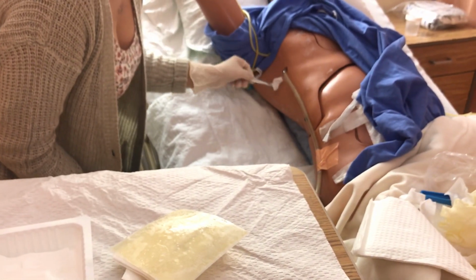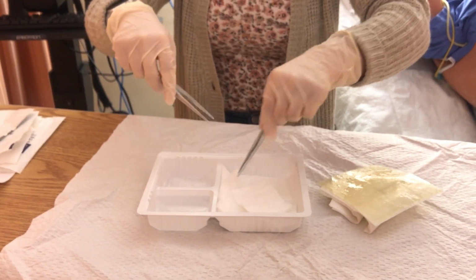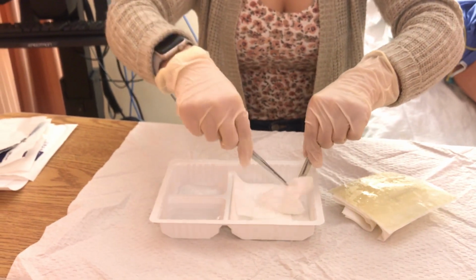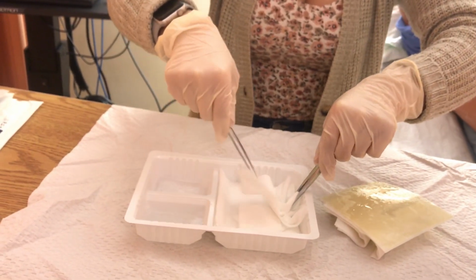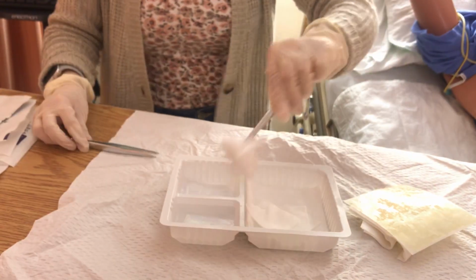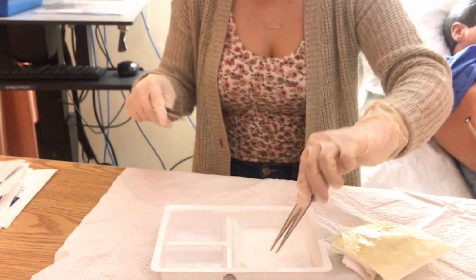And then an even larger circle. So I'm going to put in mine. And use one of my 4x4s to clean the chest tube as well. And I'll just keep that on for a moment and I'll clamp it off so there's no excess pressure in the line. And I'm going to do my second med check before I hook them up here. So right patient. Clean the tubing. Now I'm going to dry it off.